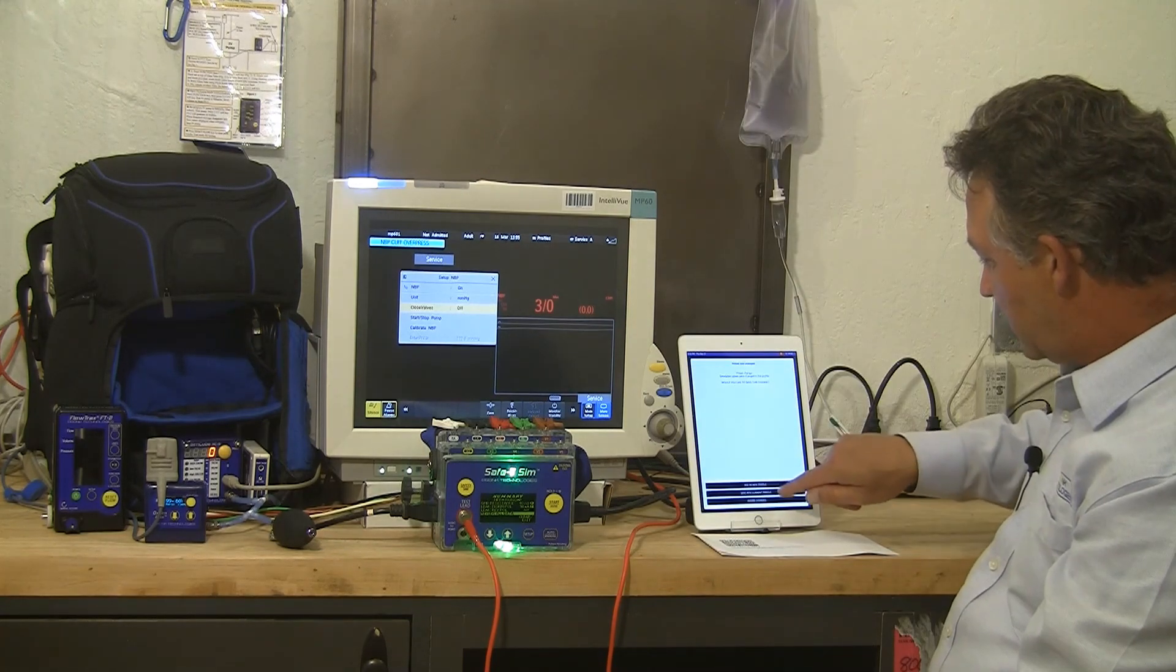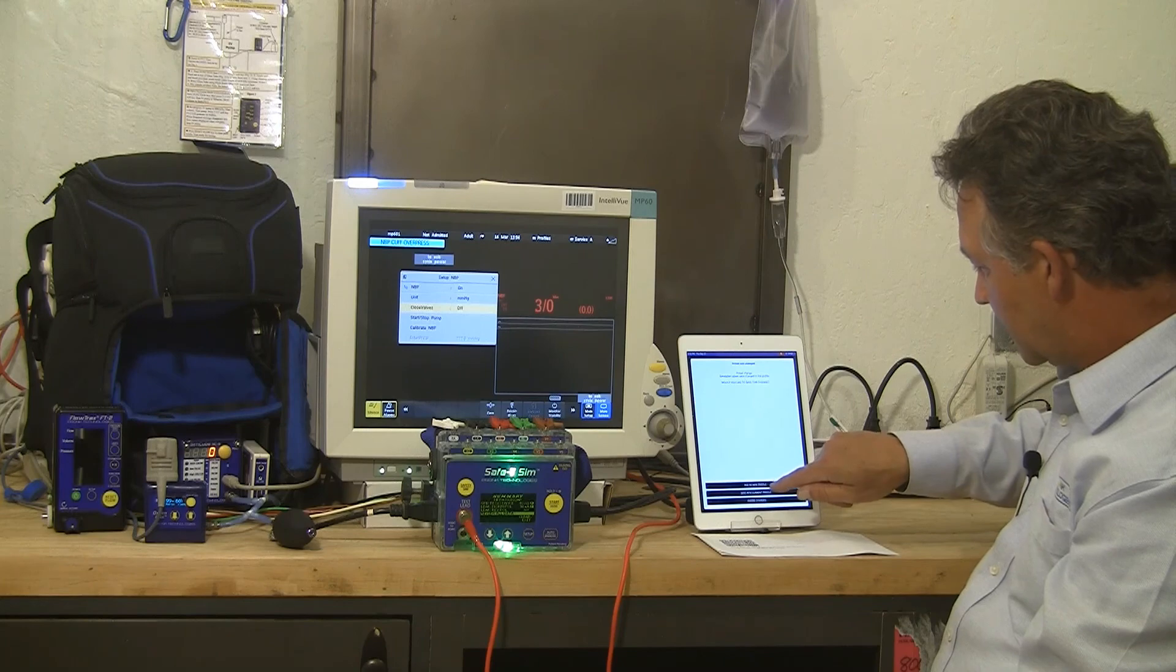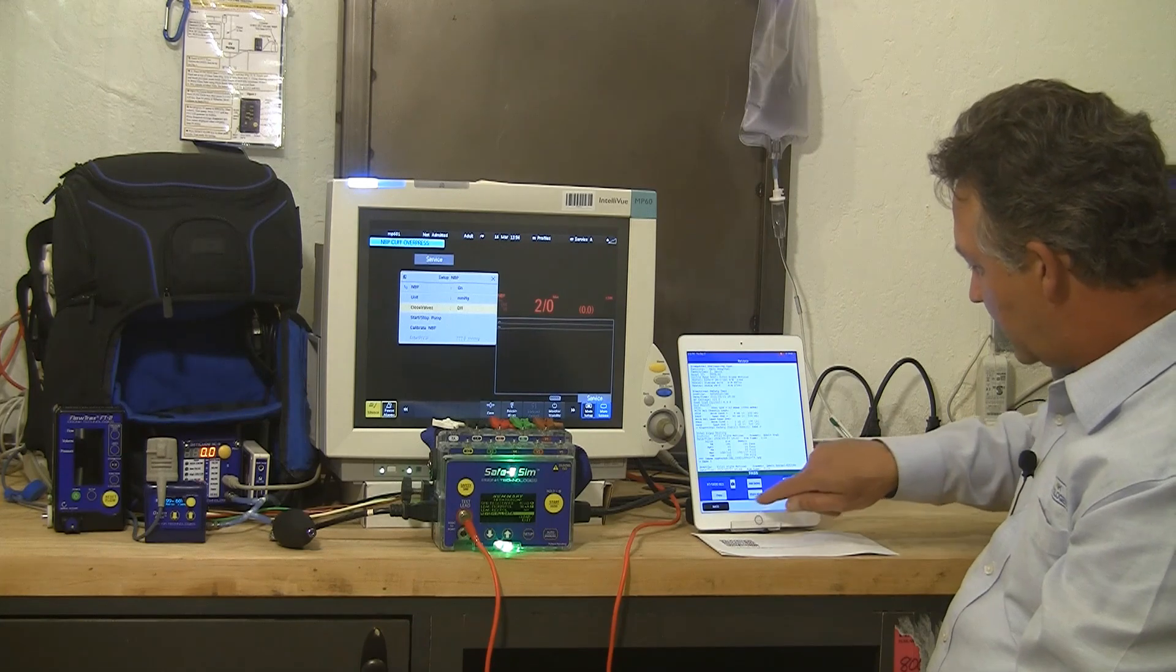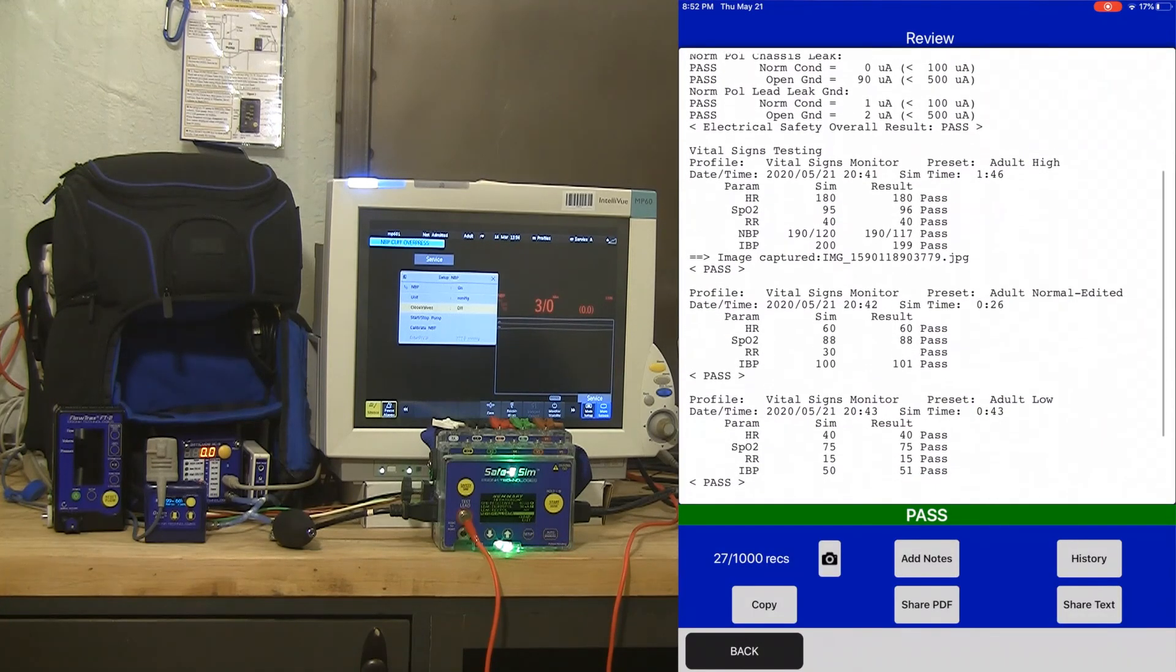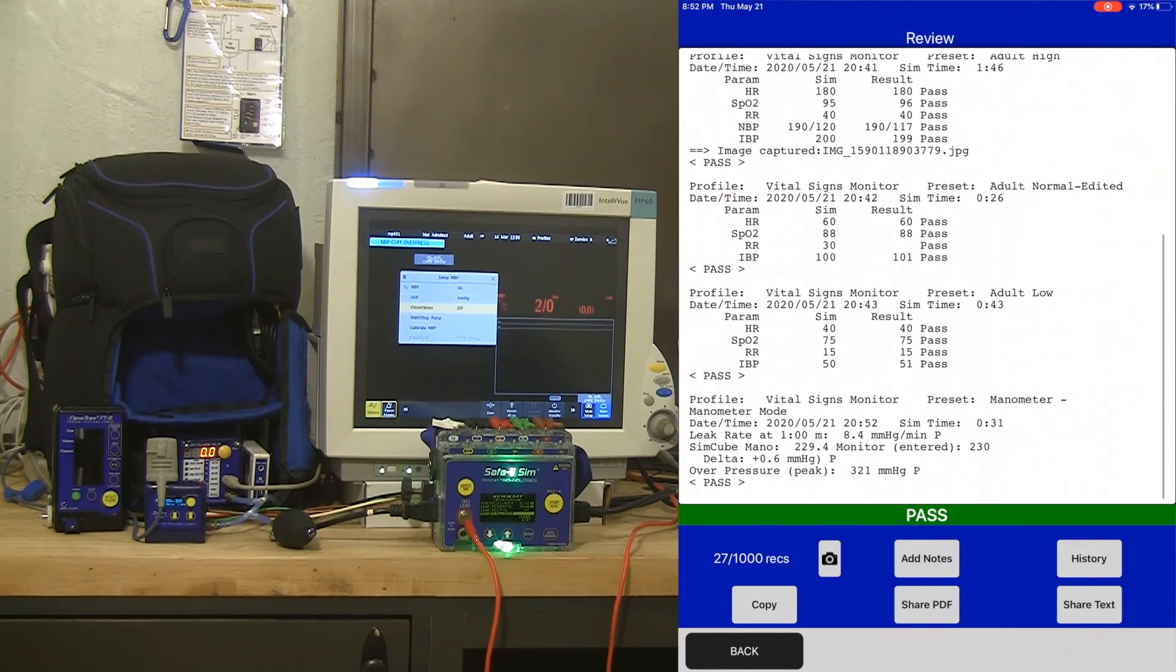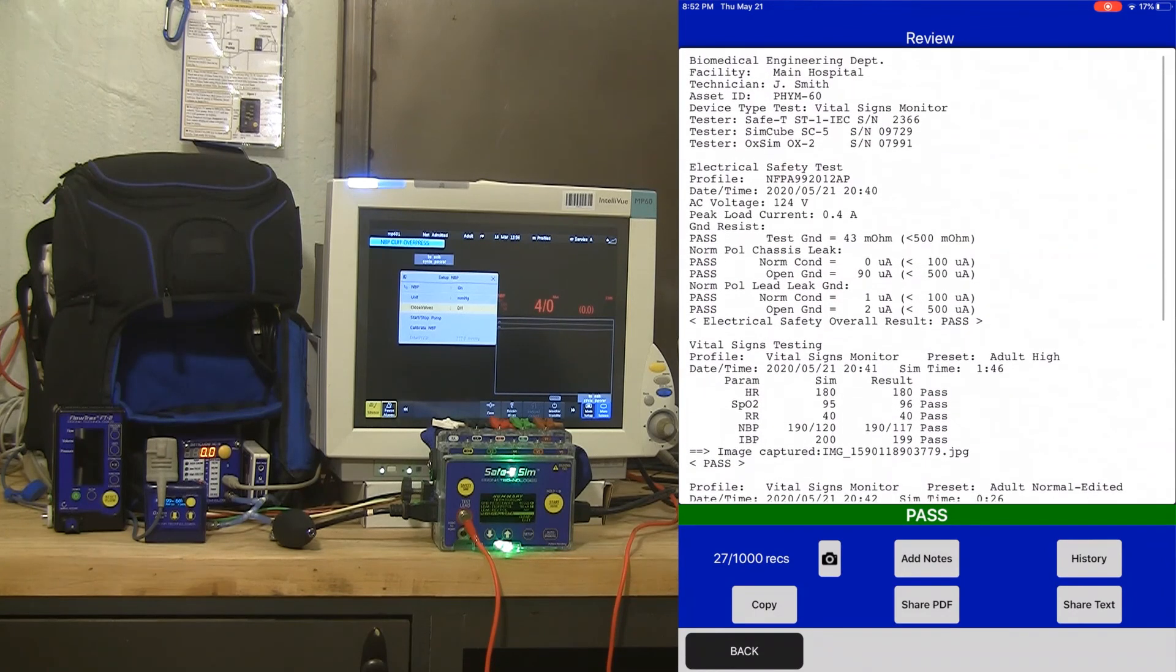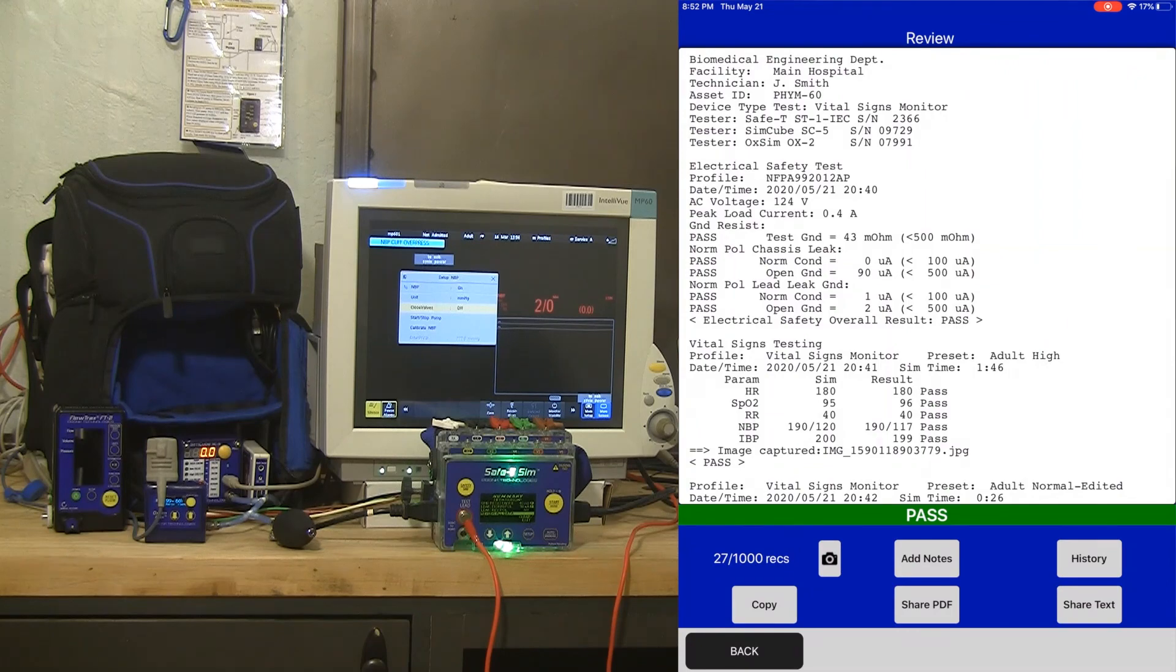From here I can look at the entire record of all the detailed testing I just did simply by tapping through those steps on my iOS device capturing results controlling my test equipment.